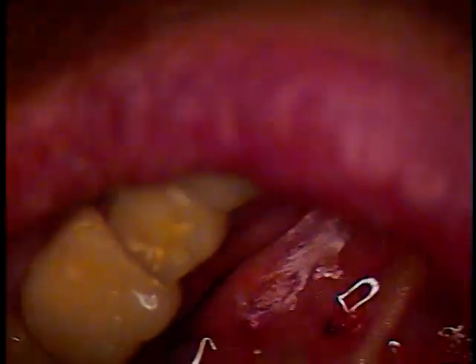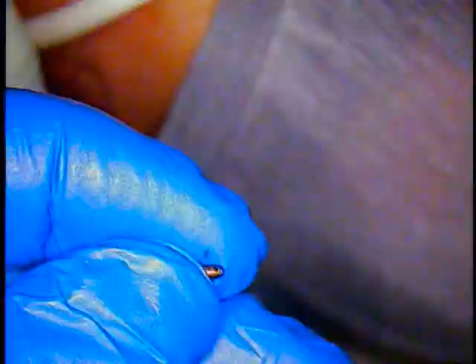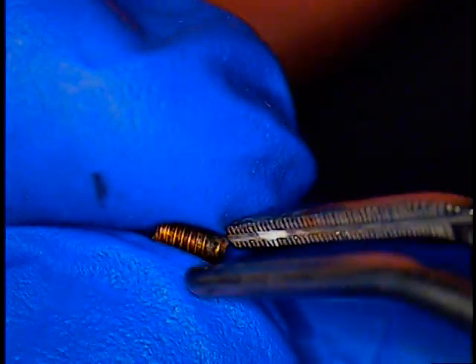I'll show you the finished product here, folks. There's the screw. What we're going to do is put a little plug in there for our patient so she can get right back to her dentist. This is Dr. Jerry Cuomo with another successful rescue case. Everybody's cheering back here, thumbs up. All the best — if you've got a patient that needs me, just feel free to call the office. Have a happy day.